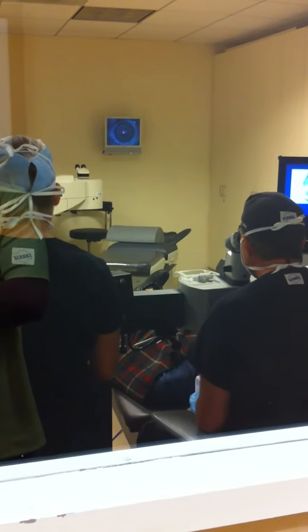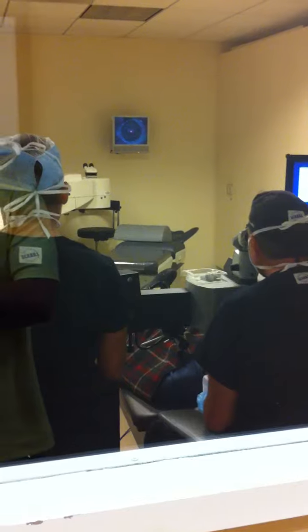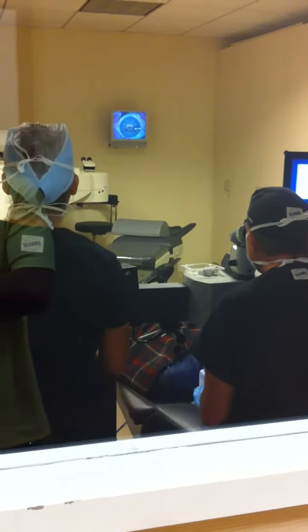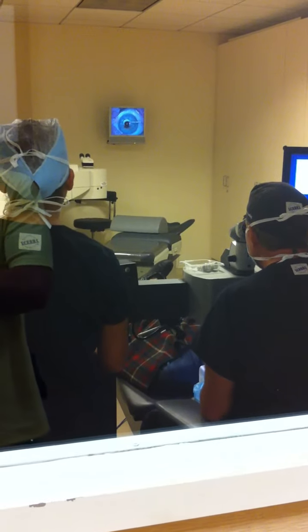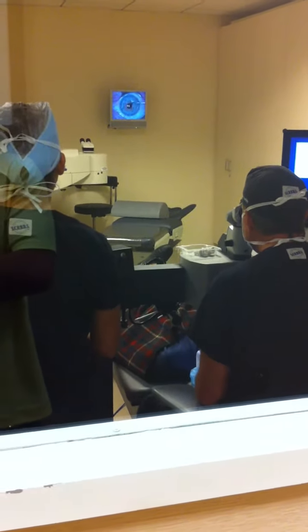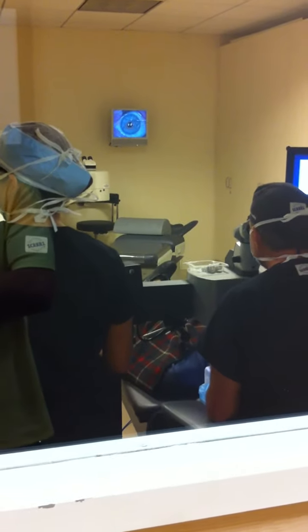This part takes away more tissue from the middle and leaves the tissue on the side, and that corrects his -4 prescription. Okay. So it has to do with... Oh! They cut a hole in his eye. Yeah, they're changing the shape of the cornea. Okay. So it's kind of like the shape of his eyeglasses.